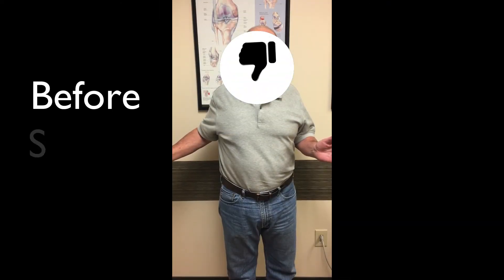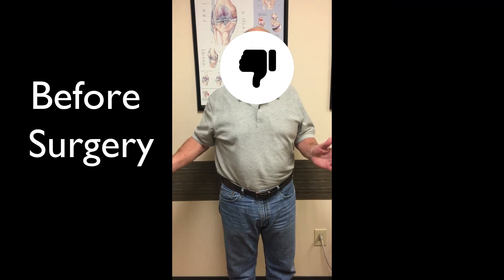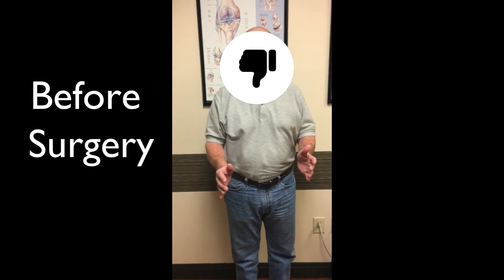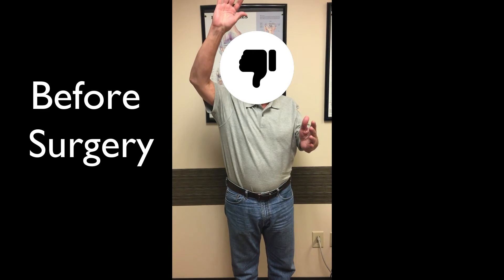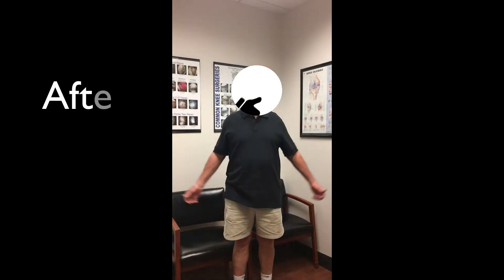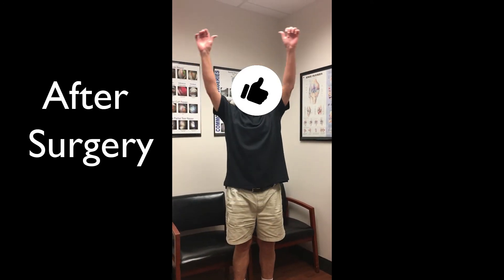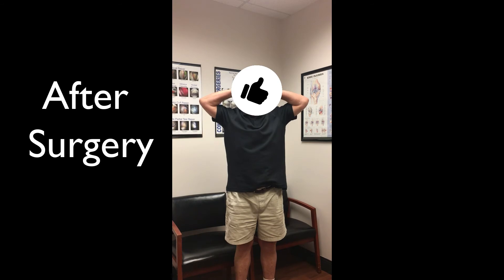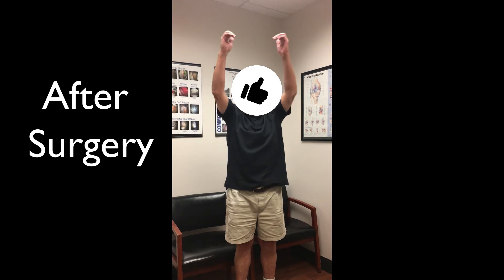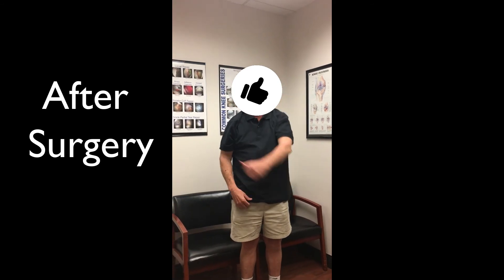By using this technology we were able to restore this patient's anatomy, relieve his pain and dramatically improve his function. This technology is not necessary for standard cases but can provide critical assistance in situations where severe deformity makes proper replacement of the implants challenging.